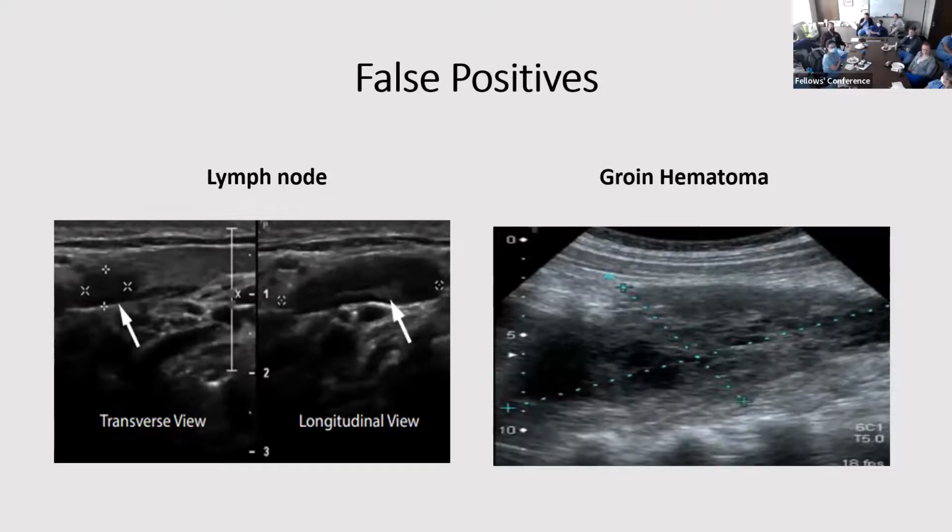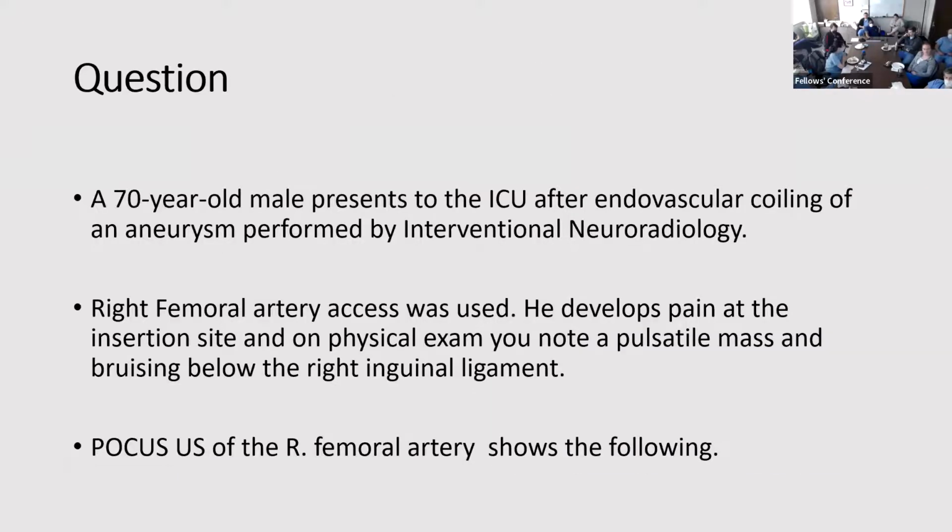Lastly is a growing hematoma. This one can be a problem. If the hematoma is big enough, it can actually cause a DVT by compression. So sometimes you're going to have to rotate the leg, do a lot of moving around the patient to try to trace that vascular anatomy. But the hematoma can be a significant problem. And then what do you do if they have a hematoma and DVT?